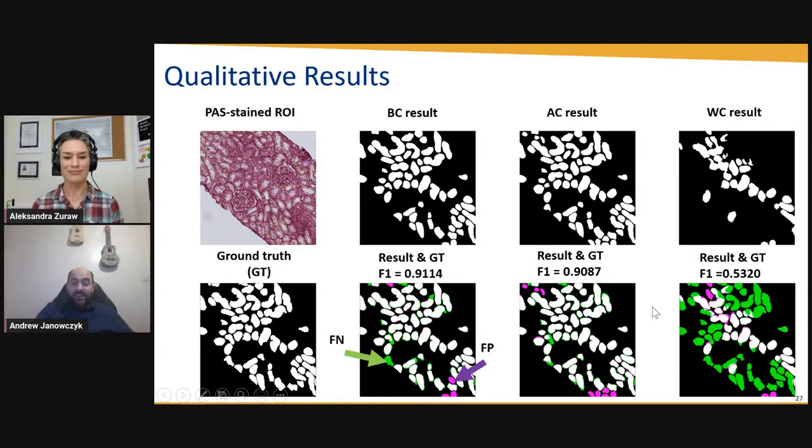And again, you exist somewhere on a spectrum between these results and these results, and you don't know where you are. And just by providing better data partitioning, which again is going to take you 15 seconds if you use Cohort Finder, you'll be able to improve. In this case, it looked like we improved about 40% in absolute terms. Same model training, same augmentation, same everything. The only thing we changed was how that data was partitioned.